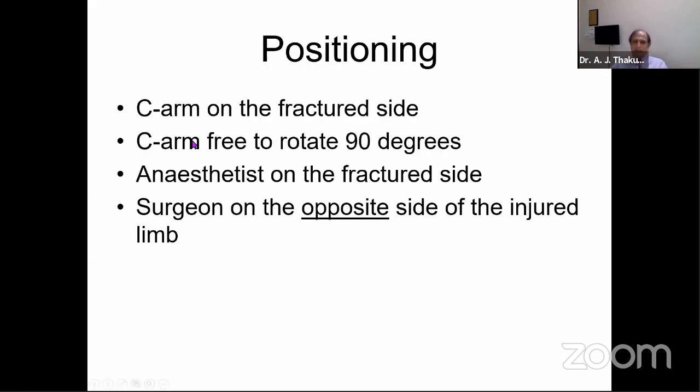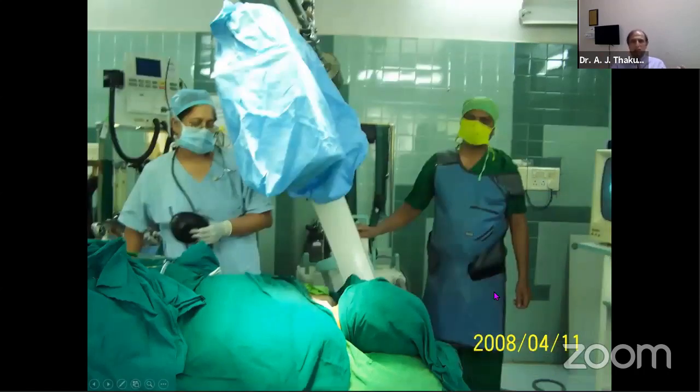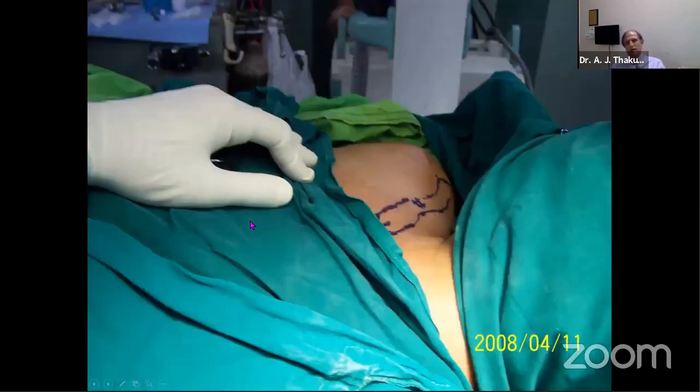The C-arm is on the fracture side. The C-arm is free to rotate 90 degrees. The anesthetist also stays on the fracture side. The surgeon works from the opposite side because the entry is from the medial end of the clavicle. Here we are. This is the fractured side, anesthetist and the technician. One can view this way and that way, so you can see how the two views are possible. The fracture line is marked, and then the entry can be achieved through the other side.